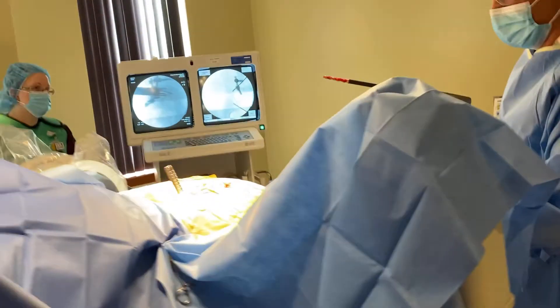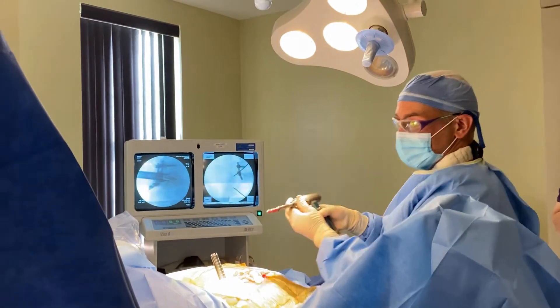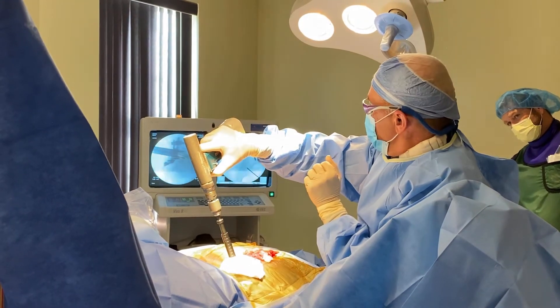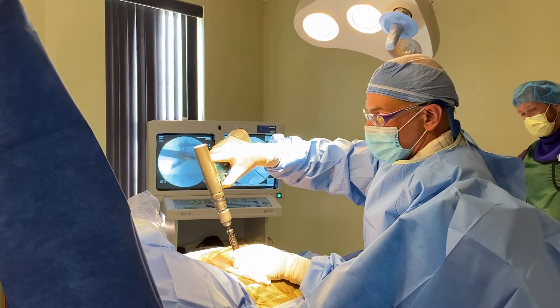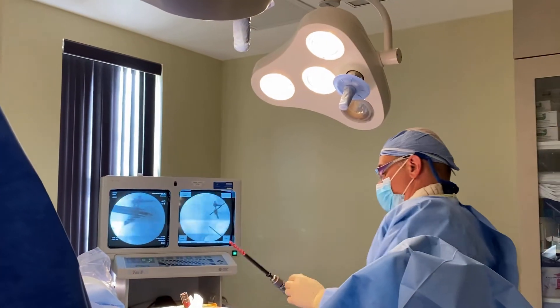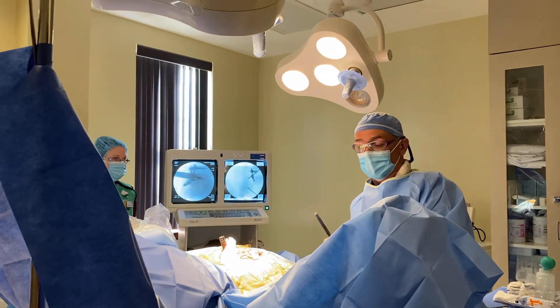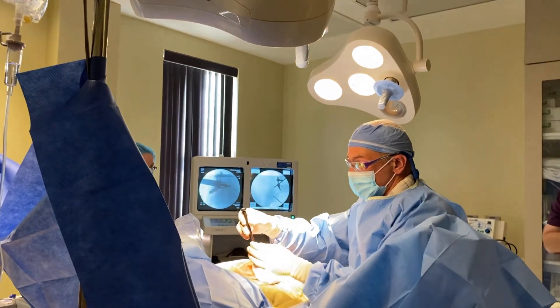We're ready to drill the cavity in the superior pole of the SI joint. It has a safety stop so you can't drill too far. The cavity has been created. Ordinarily with a younger patient you would need to broach — turning that round hole into a square hole with this device — but since this patient is a little osteoporotic, we can skip that step and go ahead and deploy the demineralized bone matrix right into the opening.